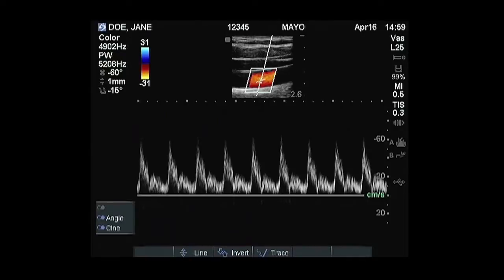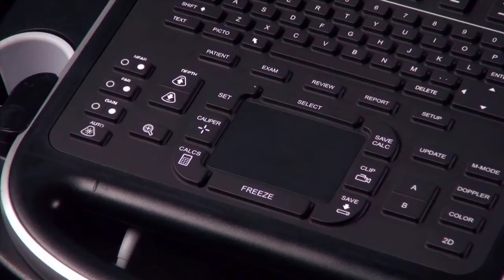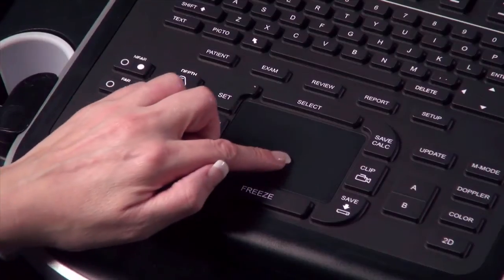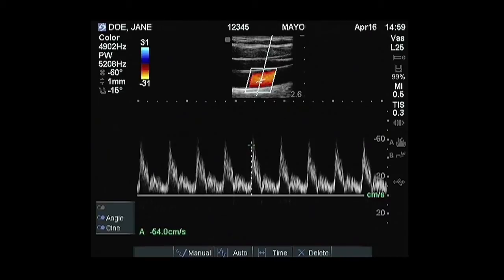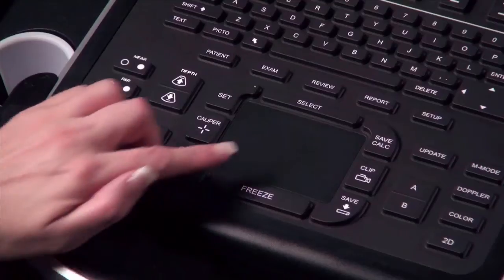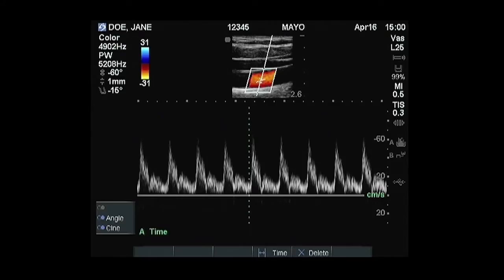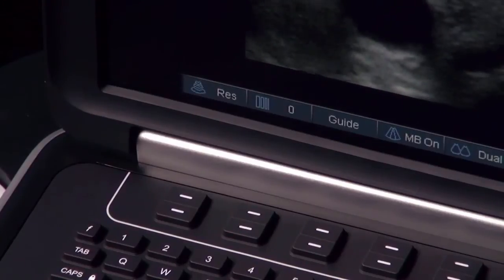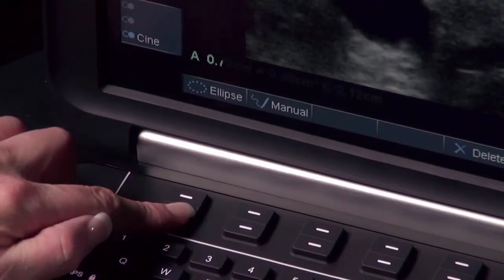A measurement may be performed on a frozen image. Activate calipers by pressing the caliper key. Move the caliper to the point of interest by using the touchpad. An active measurement will be displayed in the bottom left corner. To perform a linear measurement, place the caliper at the point of interest and press the select key. Another caliper will be activated; move it to the point of interest to complete the measurement. Area measurements may be obtained by using the ellipse or manual trace methods.